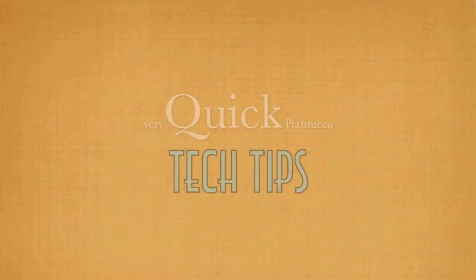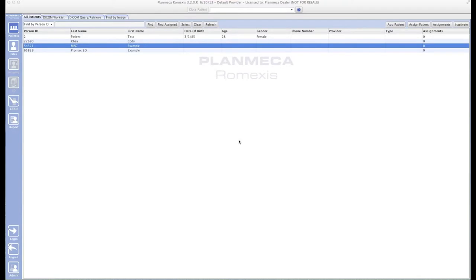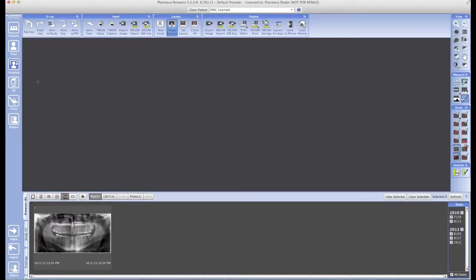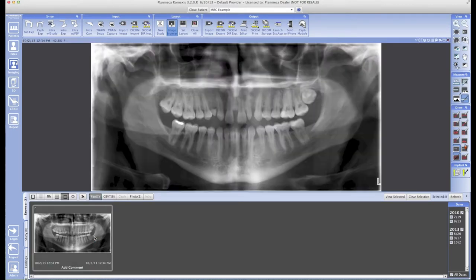I have Romexis open, and the first thing I'm going to show you is how to export your extraoral bitewings, your pans, and other two-dimensional images. Those tend to be easier to do because you don't need a special viewer—pretty much every computer these days is capable of opening a JPEG or TIFF file. So let's get down to it.